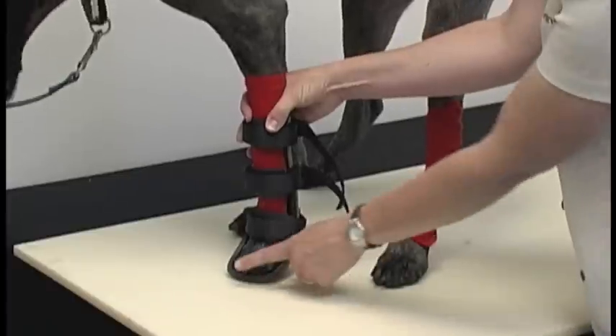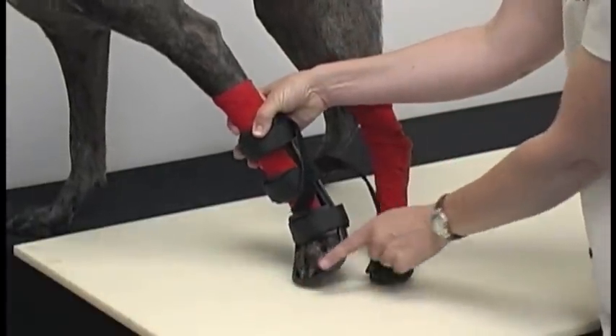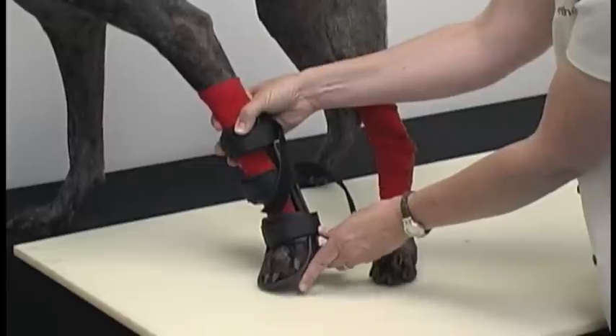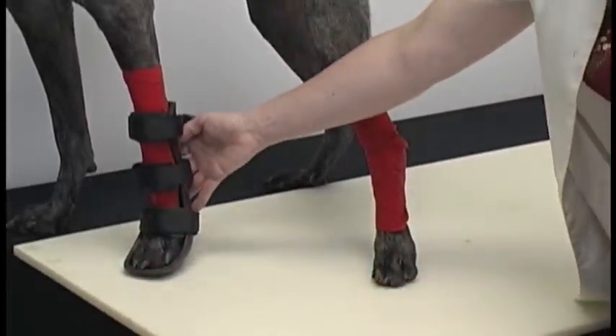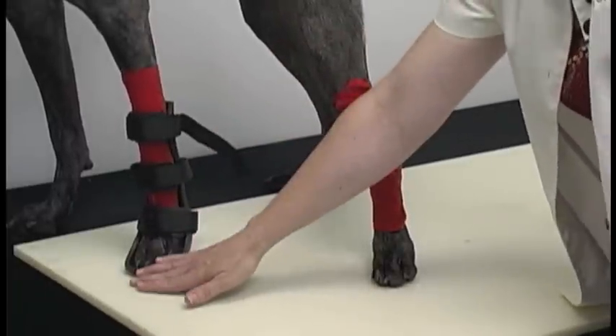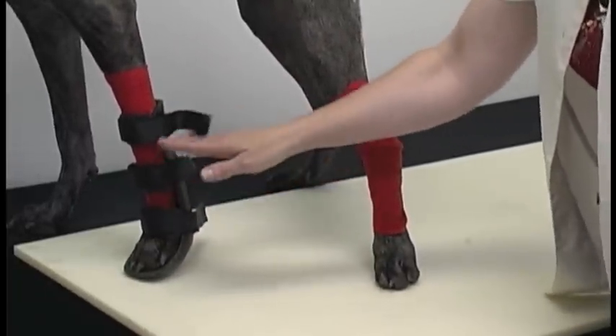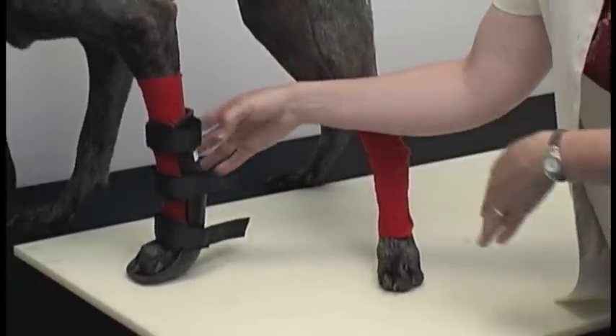Notice the toenails are on the splint. Some will hang over and that's okay, but you don't want the pads to hang over. The splint is fitting correctly the way it should right now. If it isn't, the toenails would hang over and you may not have the carpal pad in alignment. If that's the case, take the splint off and try again.